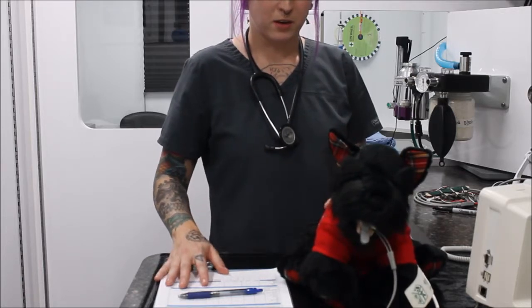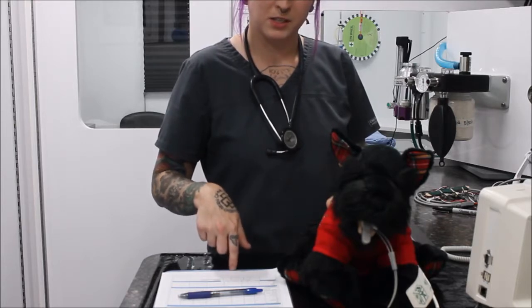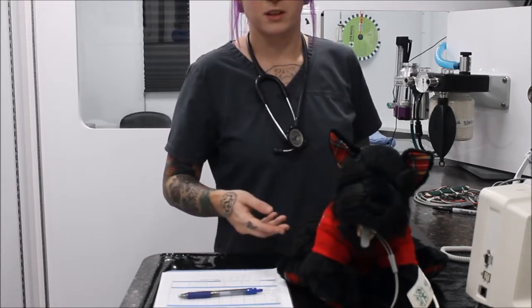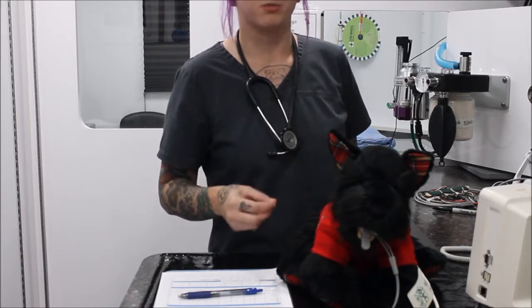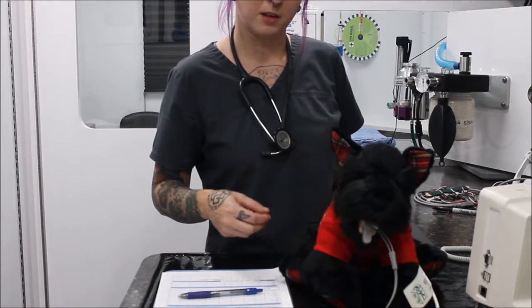And then we have our surgical stage 3, plane 1. Usually they're unconscious, but they're light. Respiratory rate or heart rate might be a little bit increased. Respiratory rate at this point should start to become normal. It's usually when we start to hook them up to the anesthetic.